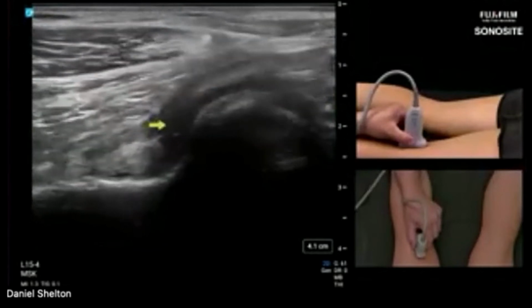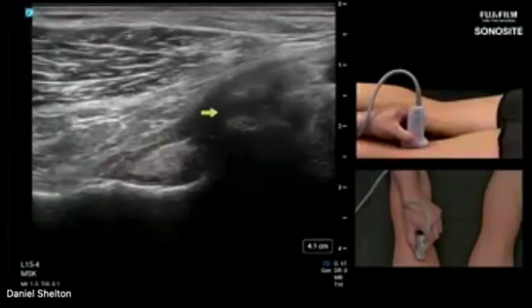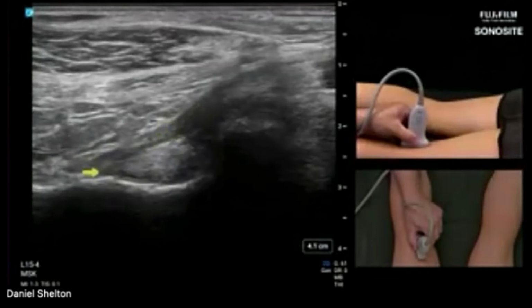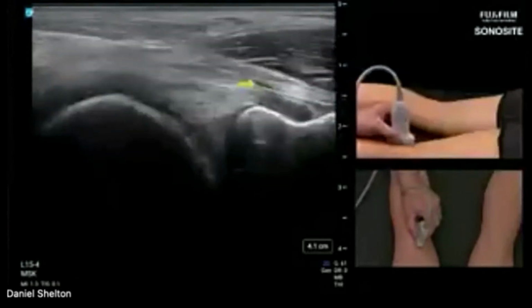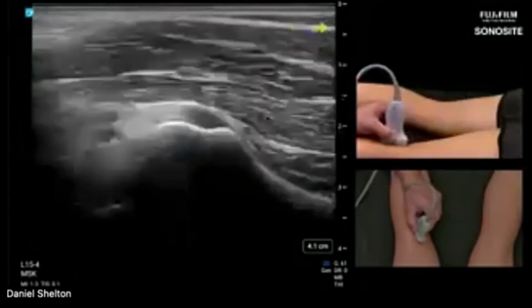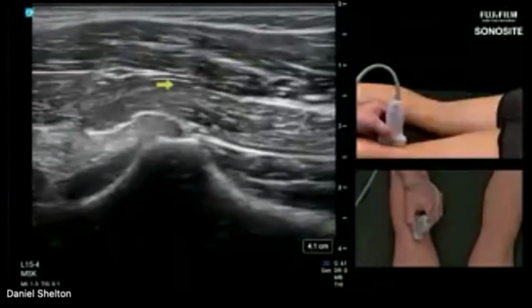I had not scanned ahead of time and didn't know I was going to see that so clearly, but kind of like scanning a distal biceps tendon in the elbow, I'm just doing a little bit of heel-toe rocking and getting that tendon origin, medial head gastroc, to look really nice and pretty. So we'll scan that back up to its muscle. If you see Baker cysts in this area and they're ruptured, they'll typically track down the medial head of the gastroc and sit between the medial and lateral heads, or just superficial to that medial head is pretty common.